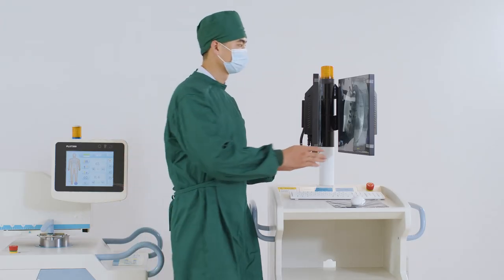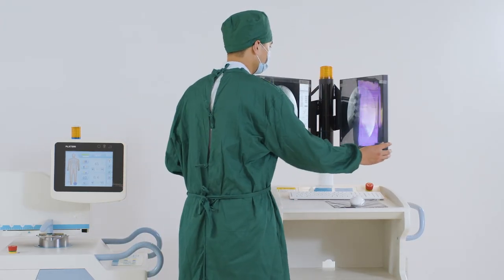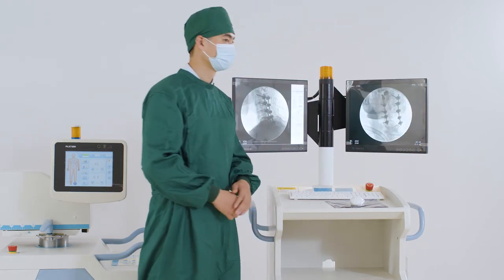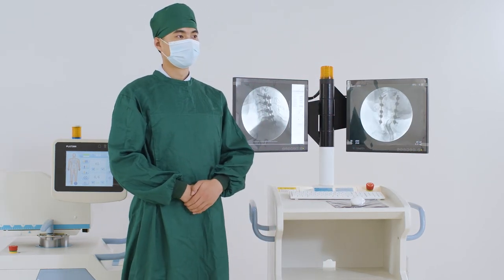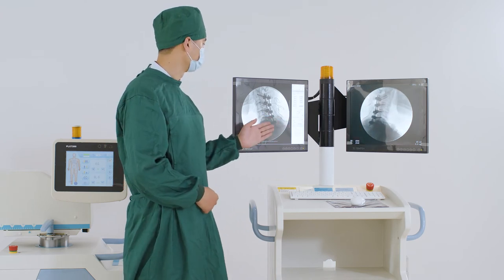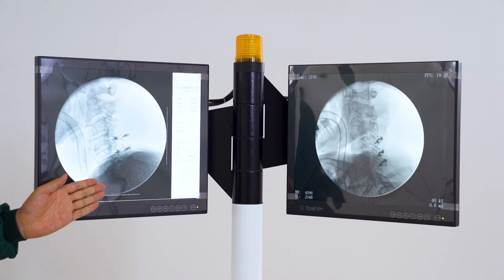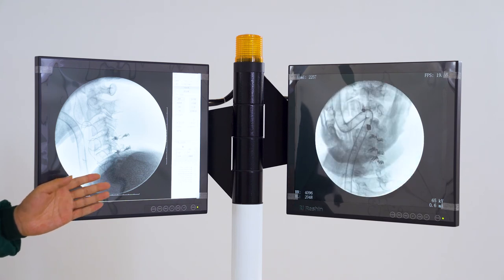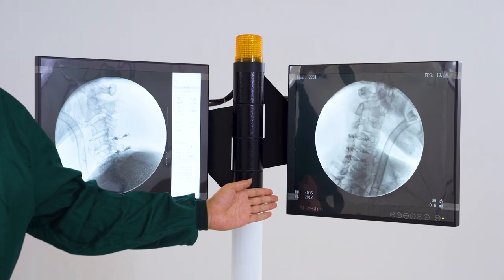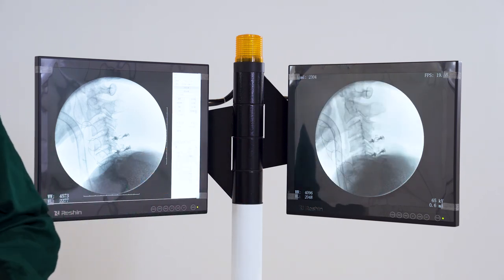Two high-definition medical monitors can be rotated freely on both sides of the host, which is convenient for doctors to observe sharp images from multiple angles. One monitor can display the two-dimensional images, while the monitor on the other side can be used to observe the reconstructed three-dimensional image.